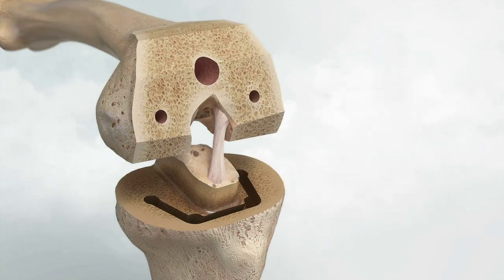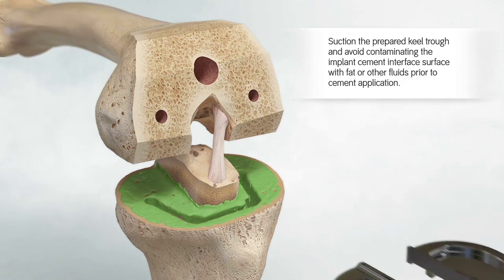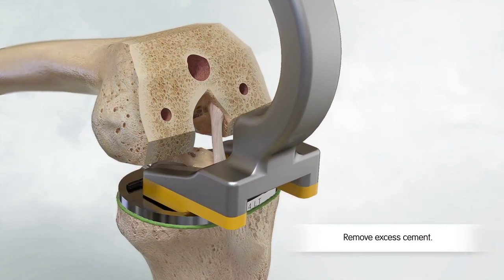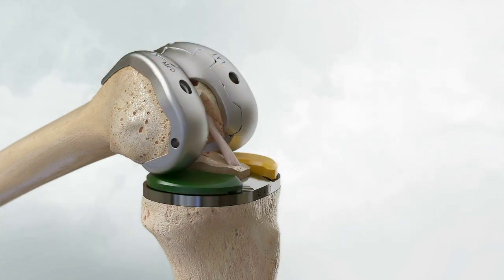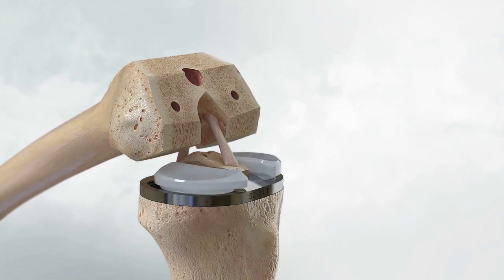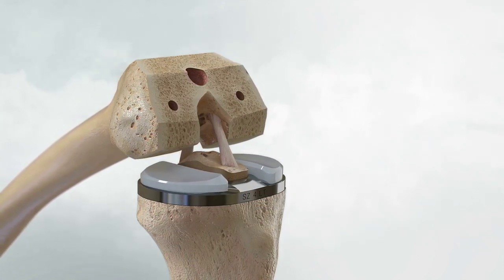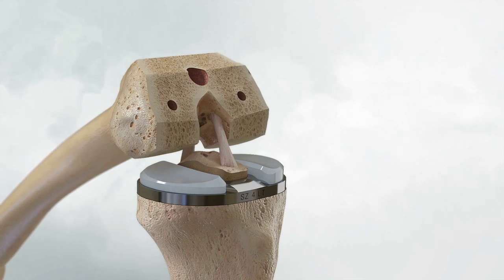Flex the knee and place a thin bent Hohmann laterally. Apply generous amounts of cement to the dry underside of the baseplate, keel, onto the tibia surface and into the prepared keel trough. Use the tibial implant impactor and a mallet to fully seat the tibial baseplate component onto the proximal tibia. Clear any debris from the locking mechanisms. If final trialing is desired, use the determined medial and lateral inserts and place them into the baseplate implant; adjust where appropriate. If balance is appropriate, insert the final insert implants. Grasp the anterior aspect of the lateral insert implant with the inserter tool and seat the insert implant posteriorly into the baseplate until the insert begins to engage posteriorly. Using hand pressure, fully seat the insert implant applying a posterior force and then downward force on the anterior aspect of the insert to fully engage the locking mechanism. No impaction should be needed.